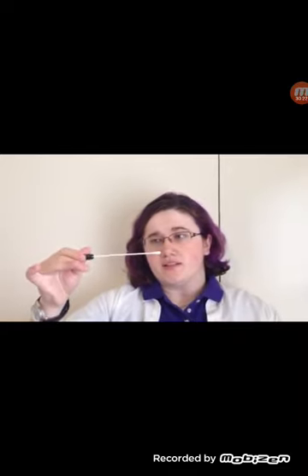Then you'll take out the swab. And this is the motion that you'll be making. With your fingers, you will be making a clockwise and anti-clockwise motion while moving your hand up and down and side to side. This will allow us about the maximum amount of buccal cells to be collected. And please don't be afraid to go along the gum line. The gum line is the space between your teeth and your cheek.